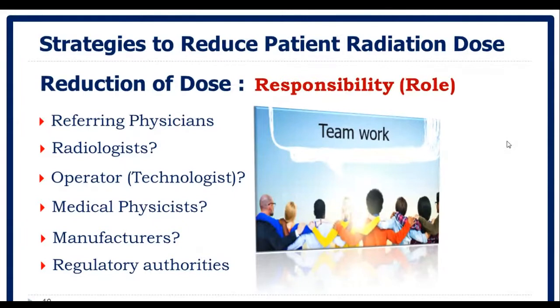Many people think that this is the responsibility of the medical physicist. The medical physicist is part of the team, and yes, he's responsible to monitor, to record and analyze those levels and provide reports. But at the same time, without our help, he or she will never be able to organize and to achieve a better outcome for the CT department.